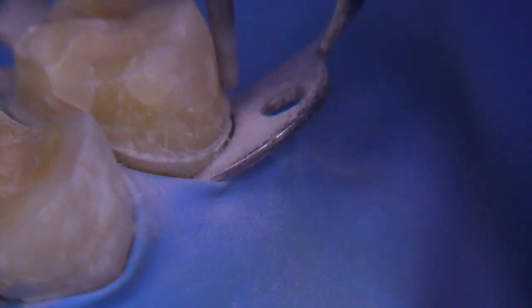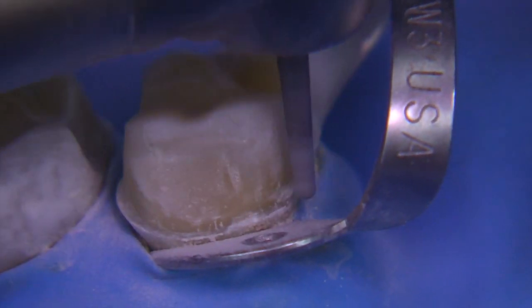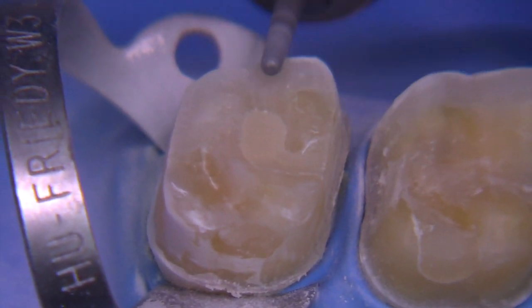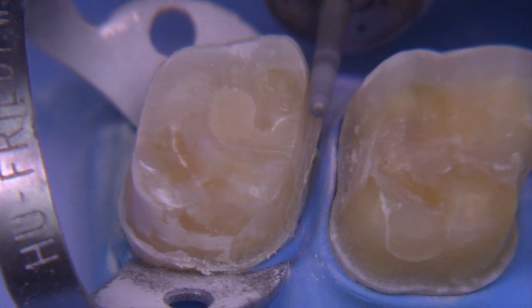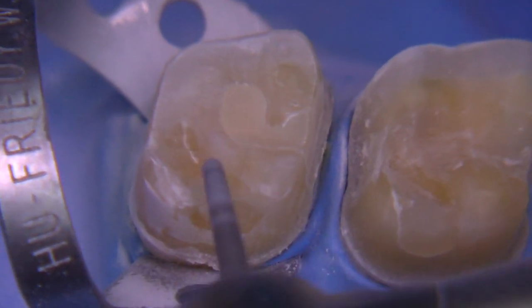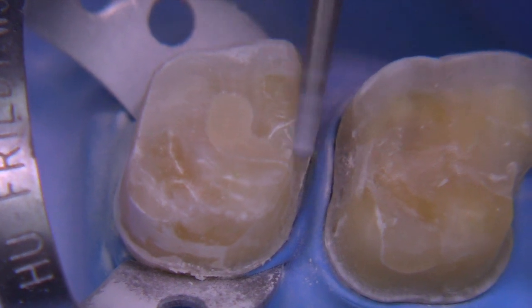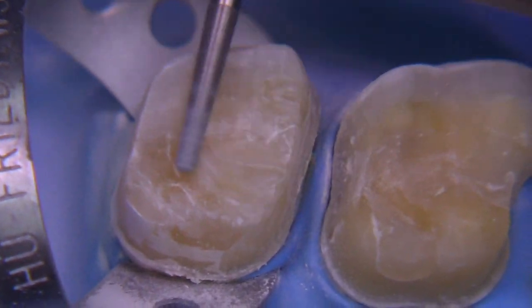You have to understand that the zirconia can be a little bit thinner in those particular areas, so it's probably better to reduce 1.5 rather than 1 millimeter so you can have a little bit more room for the zirconia if it has to over-mill. So all these little sharp edges need to be rounded — the rounder the better. I like to maintain anatomical morphological form because I like to have uniformity in the restorations and not over-reduce the tooth. There are people that will just make this too flat across the top, and that works, but I prefer to preserve more tooth structure.